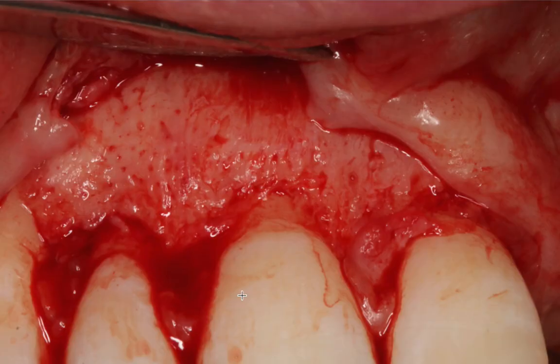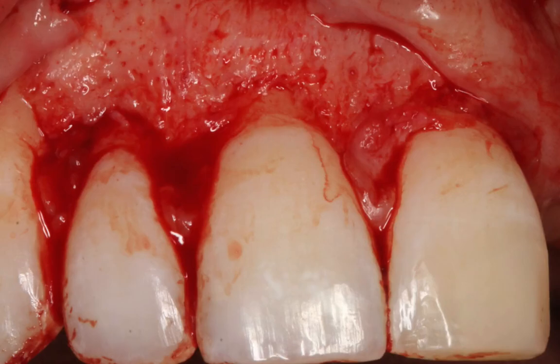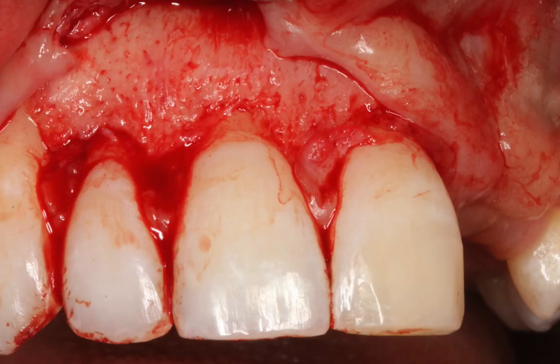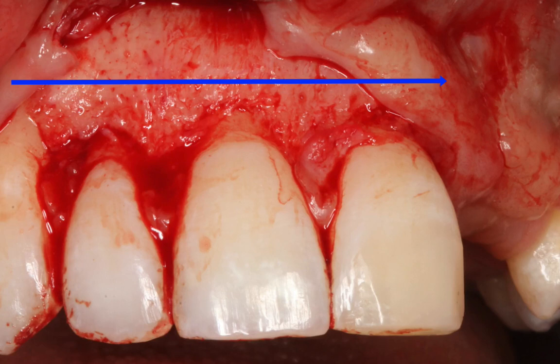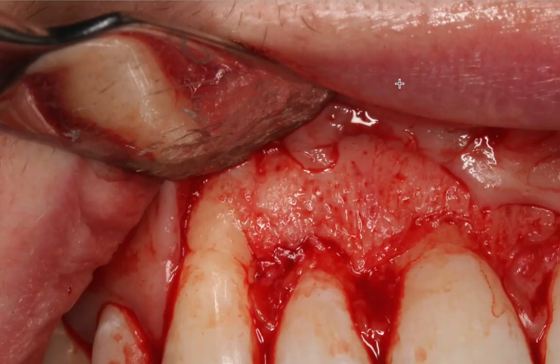Now, you'd like to be a little bit less generous in terms of your flap reflection when it comes to the frenum, because remember, we're planning to do a frenectomy, and if you reflect a flap that is relatively elaborate in the frenum area, that may become a challenge later on, as we're going to see. So the extent of the flap is from the canine on the right all the way to the left central incisor. I try not to reflect too much into the implant site because these implants still need to be uncovered. Number 2, I don't want to jeopardize what we have there because it's already deficient to begin with.